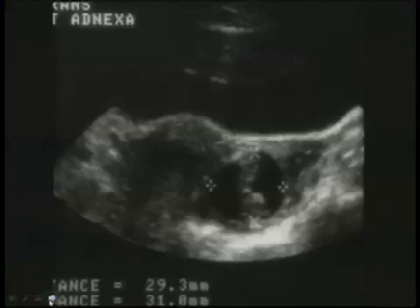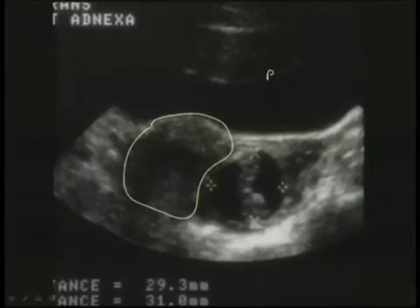Here's an example of an ectopic tubal pregnancy. This is the uterus transabdominally. We're looking through the urinary bladder here, and right here is the ectopic pregnancy seen out in the left adnexa.